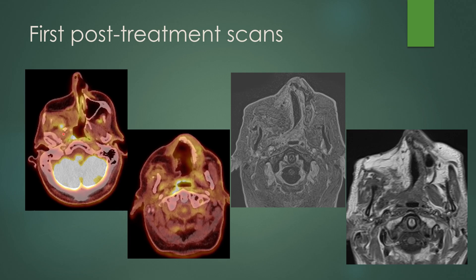Posterior to the flap, there's an area of FDG uptake but nothing really mass-like — it's right behind the flap after extensive surgery. More inferiorly, there's no abnormal uptake around the flap. On MRI, the flap is in place with no mass-like enhancement, some enhancement around the surgical site but nothing suspicious, and preserved fat planes. This would be a Category 2B — we do see some uptake and distortion that could all be post-surgical — recommending follow-up.